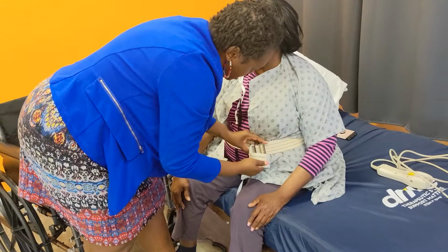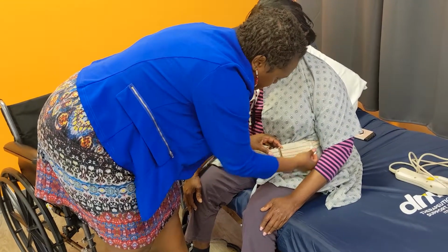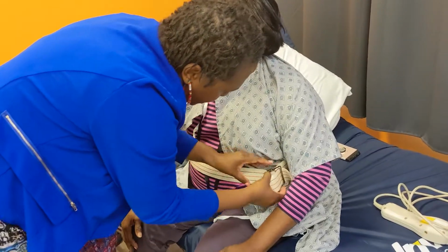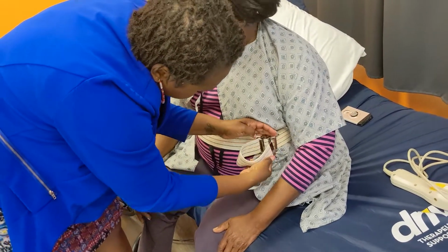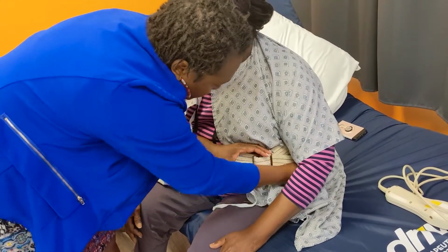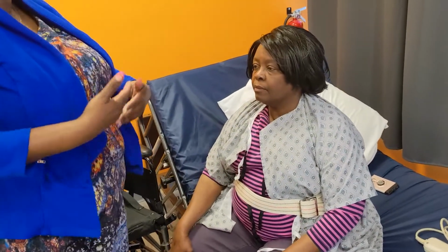All right, so it's snug. Now, if you notice, the buckle is off to the side. The buckle's off to the side. Actually, I can make that a little bit more snug. And I can fit one finger underneath, okay? So that's kind of how it's supposed to be.